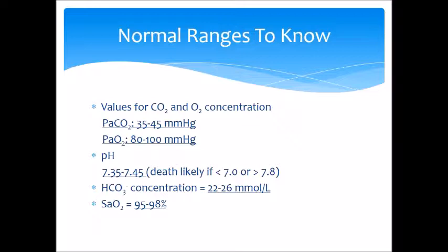For your pH, you want to be between 7.35 and 7.45. And for your bicarbonate concentrations, you want to be between 22 and 26 millimoles per liter.